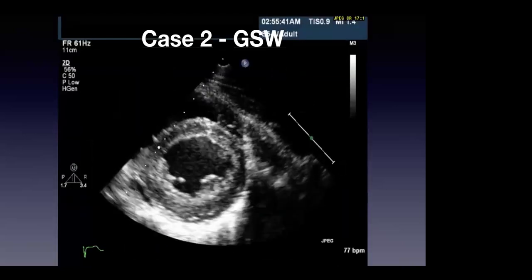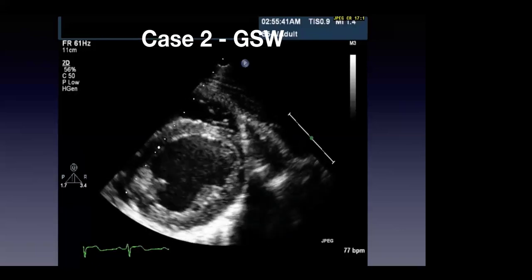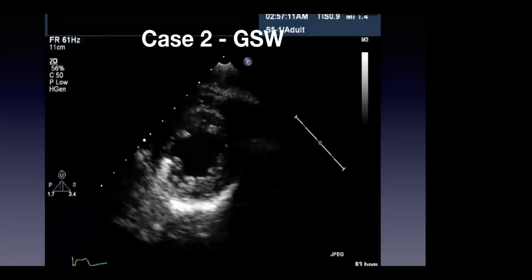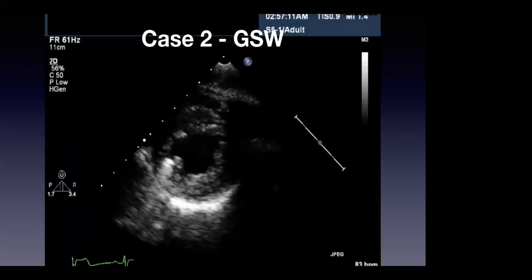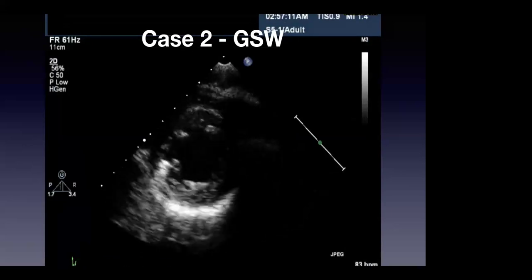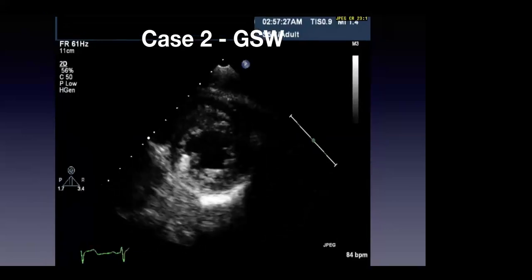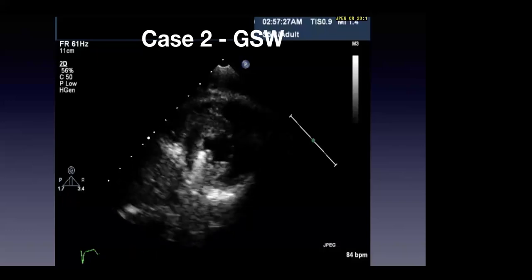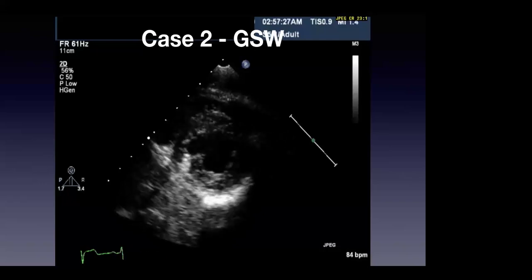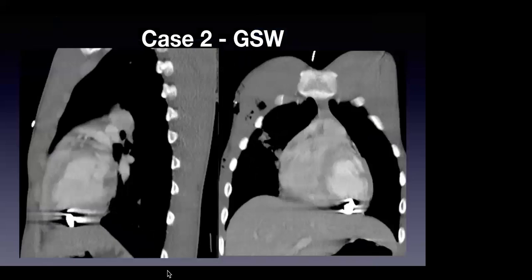So now here's short axis views. Muscle level, short axis view, again no clear effusions, although all segments seem to be thickening okay. And the same, where there's this bright structure in the interventricular septal area. You can see a bit of artifact from it, a bit of ring down artifact. Not much shadowing, interestingly. You can see it here again. I was the echocardiographer on call, and the cardiology resident who did the transthoracic echo, I can't remember what time of the night it was, was Stephanie Poon. Okay, here's a CT scan. You can see the bullet here with lots of artifact.